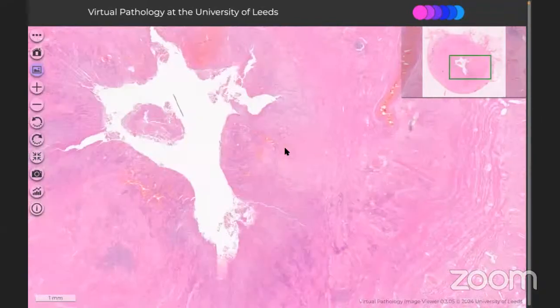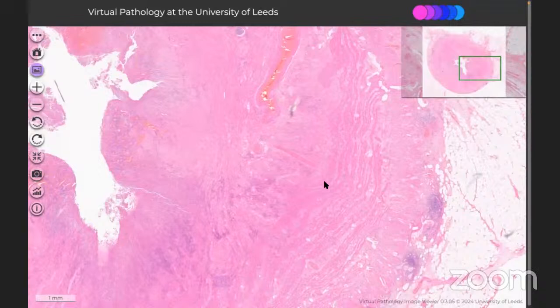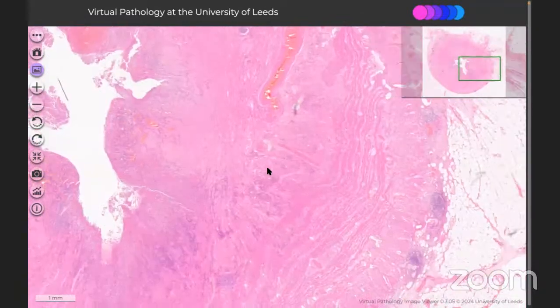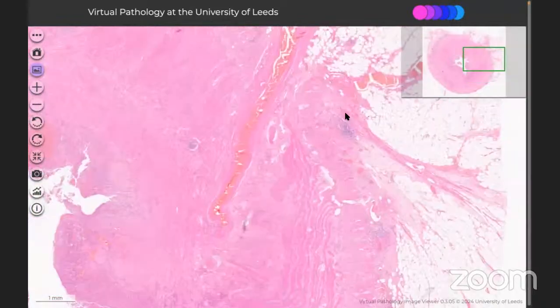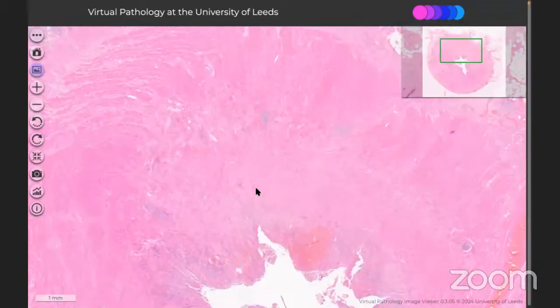And if you go along the wall of the ileum or small intestine, you will see that lymphoid aggregates are seen in many parts, also reaching up to the serosa. Okay, so serosa, muscularis and all that have lymphoid follicles.